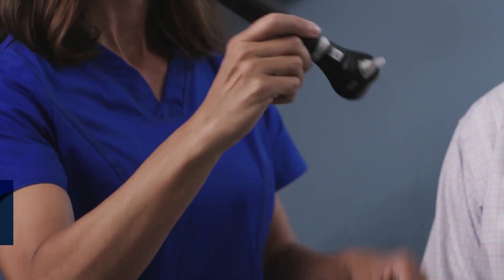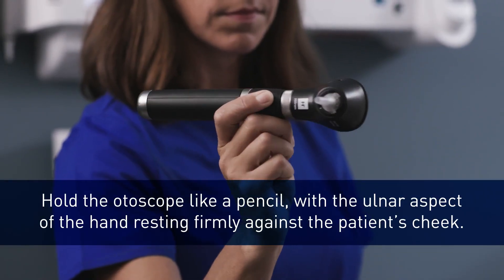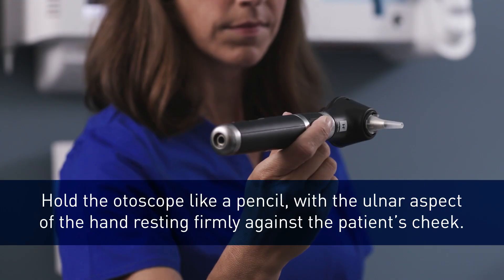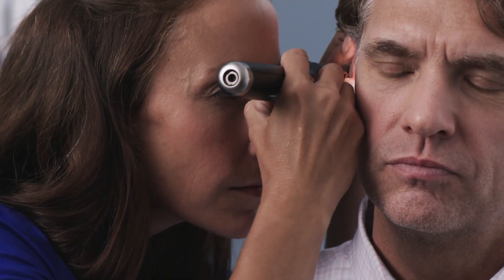For more control, some clinicians choose to hold the otoscope like a pencil between the thumb and forefinger, with the ulnar aspect of the hand resting firmly but gently against the patient's cheek. With this technique, if the patient turns or moves, your hand can move with the patient's head to prevent injury.